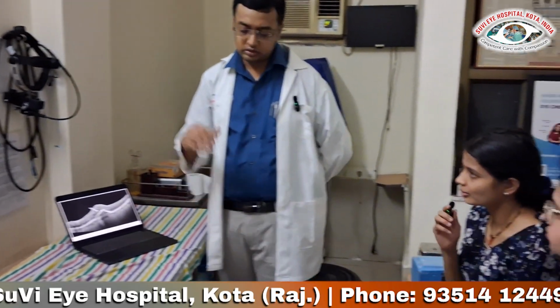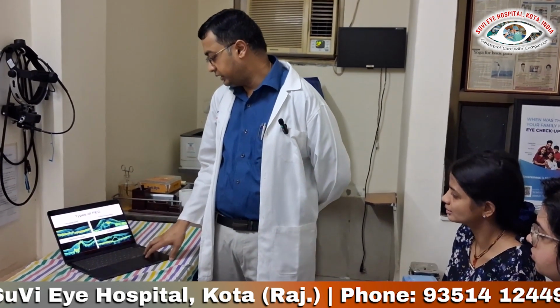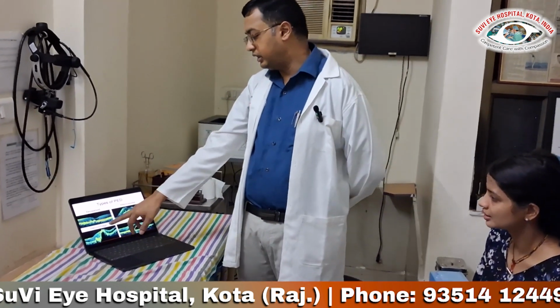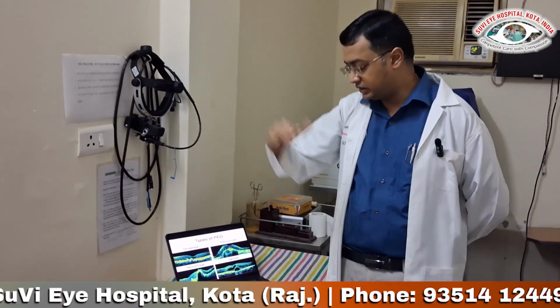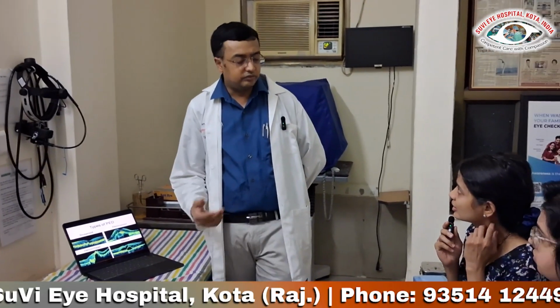On OCT we see there is a sub-RPE hemorrhagic PED, very elevated, a big PED. So what will be the first line of investigation? OCT. First line of treatment, management? Eylea injection, anti-VEGF. So she is going with aflibercept injection.